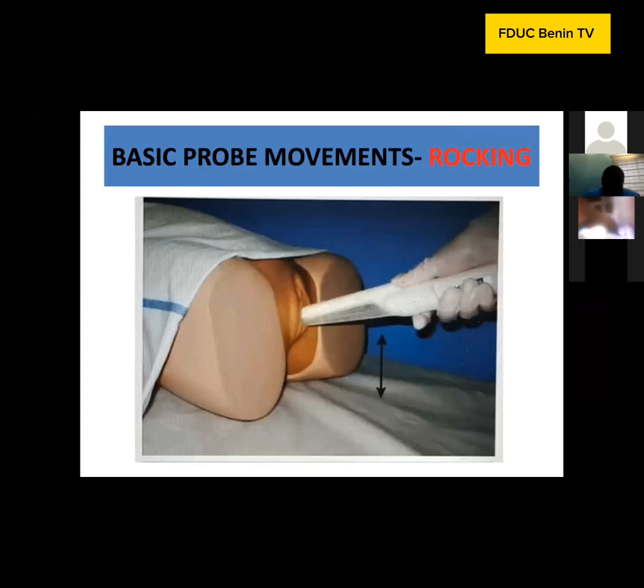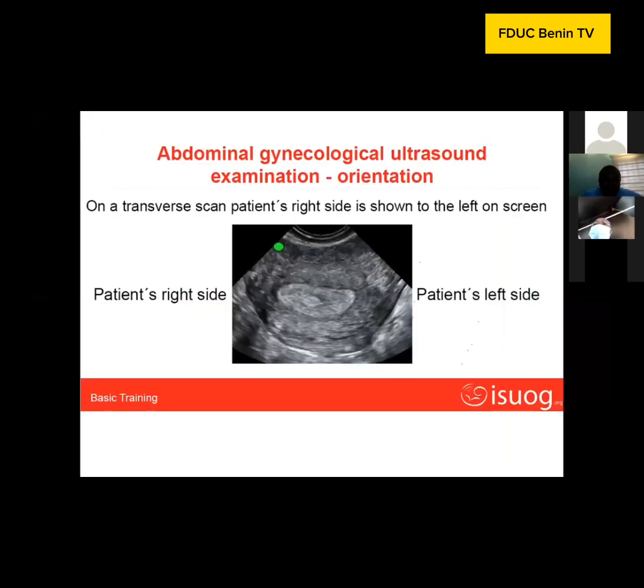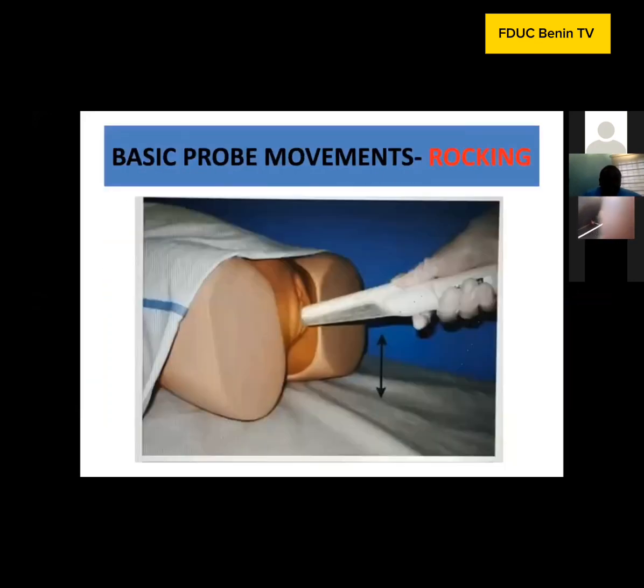Rocking is one of the last basic movements, so let me stop at this point, so that at least the basic movement will be clear to all. Let me stop at this slide I just posted, abdominal, the orientation. I have 3 more slides to present, that's it.